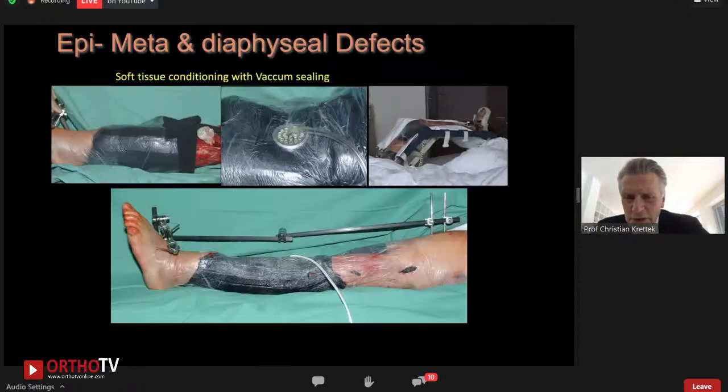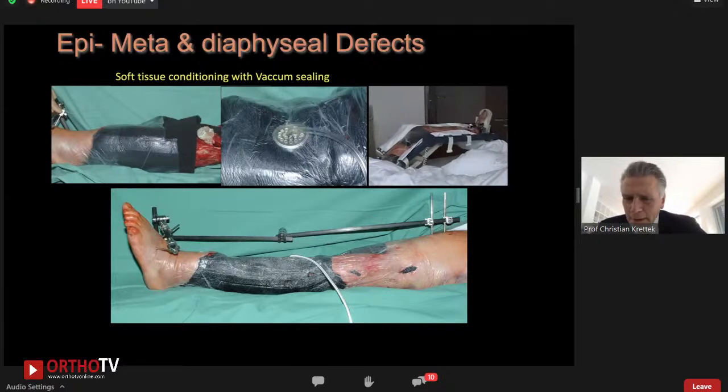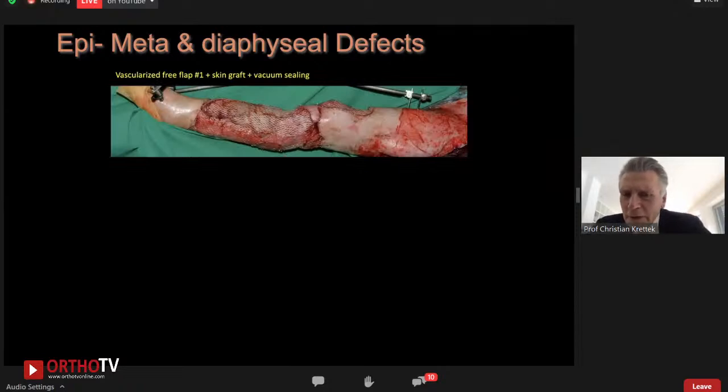And that's the situation. After the free flap, she is exercising on the CPM. We had additional external bridging fixation in order to maintain stability once she was ambulating. The vacuum sealing was sterile from the first revision. So we thought, okay, we can continue with the free flap. And that's how it looked after the free flap. And we know these large skin defects take a lot of time until they are dry and ready for the next step, the knee replacement.